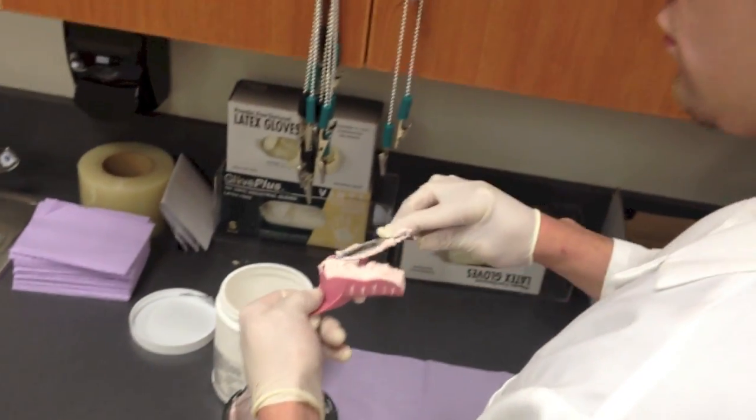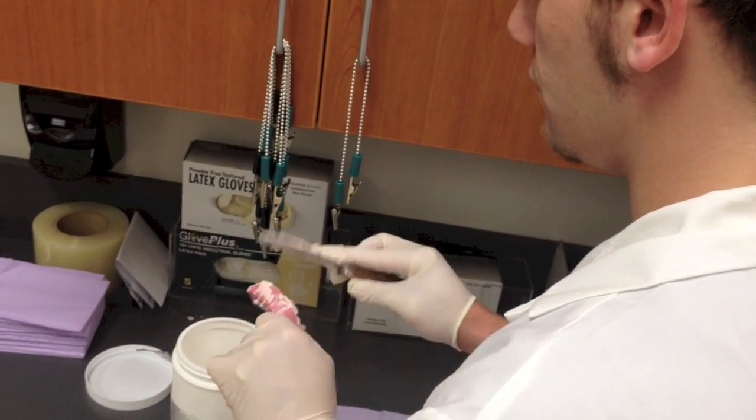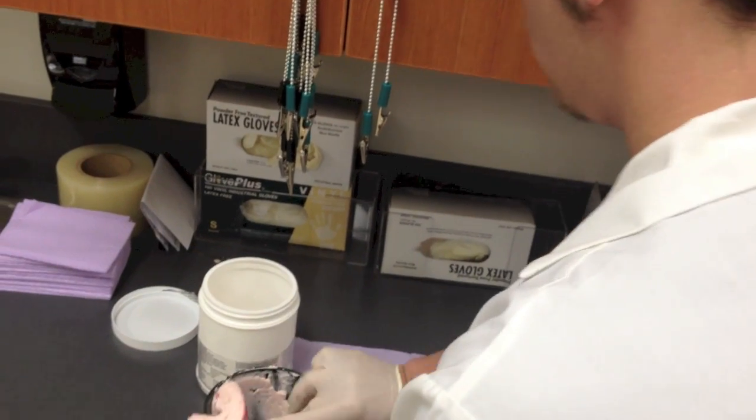Then you would scoop it onto the impression tray. Smooth it out, make sure that there's nothing sticking out. And that's how you would do the impression.